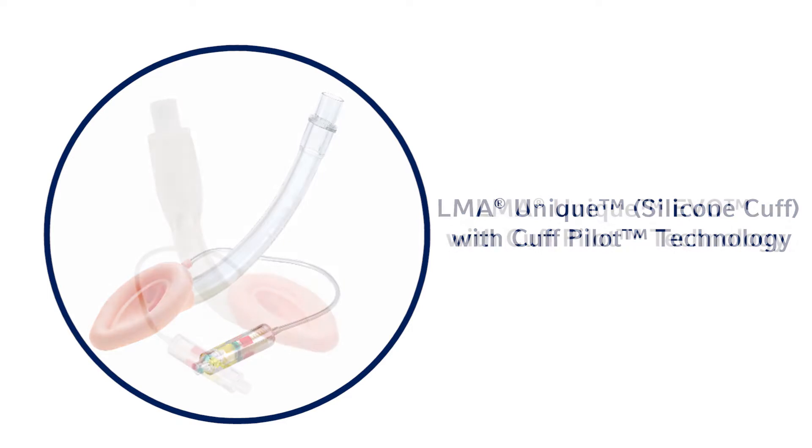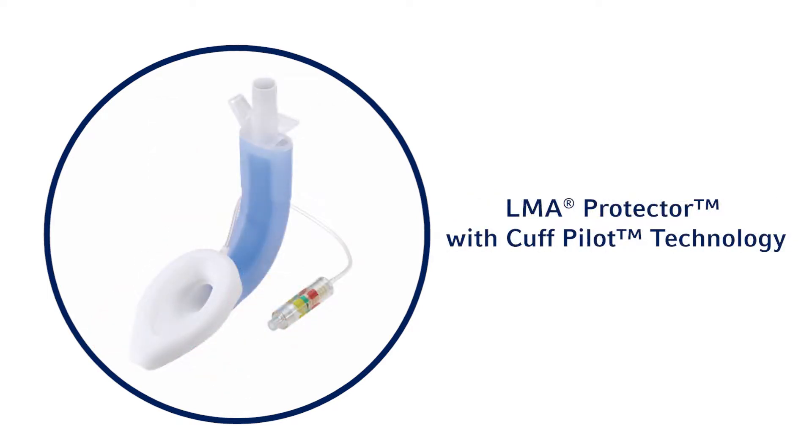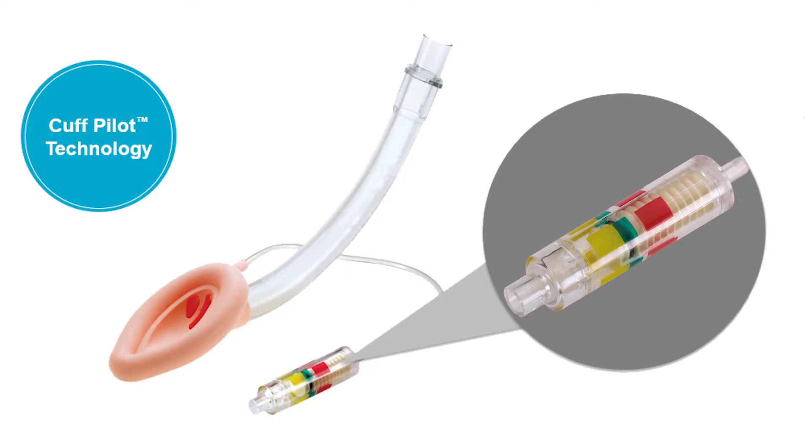Cuff Pilot Technology is available on all single-use LMA Airways with a silicone cuff from Teleflex, the market leader in supraglottic airway devices. Cuff Pilot Technology from Teleflex is an integrated single-use cuff pressure indicator that continuously monitors intracuff pressure to help detect changes resulting from fluctuations in temperature, nitrous oxide levels, and movements within the airway, providing at-a-glance feedback to highlight changes that could affect patient safety.